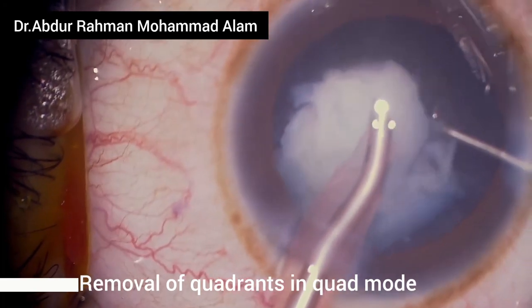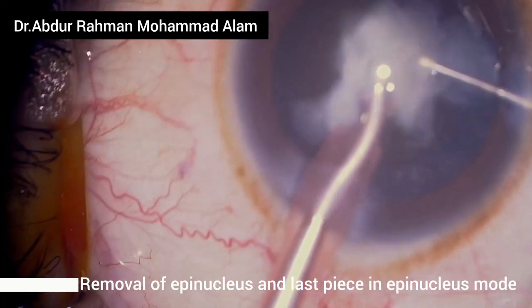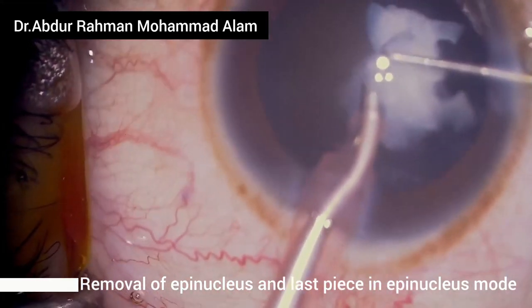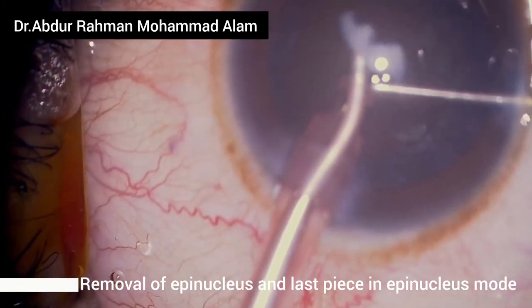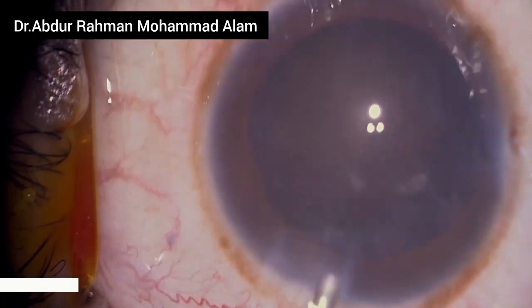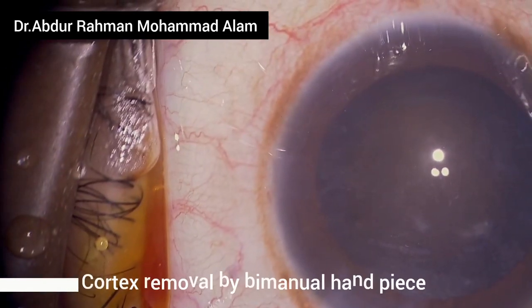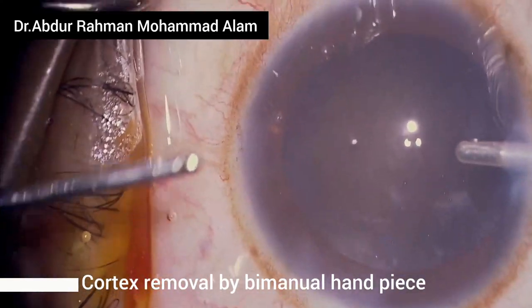While removing the last piece, go to epinucleus mode where the vacuum, aspiration flow rate, and power are reduced. After removal of the last piece, fill the anterior chamber with OVD and make a second sideport, because in this case I'll be using a bimanual handpiece to remove the cortex.